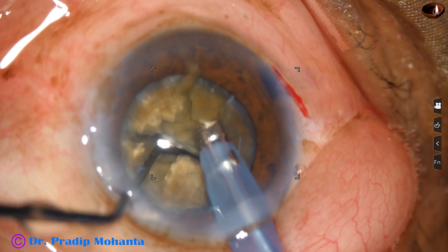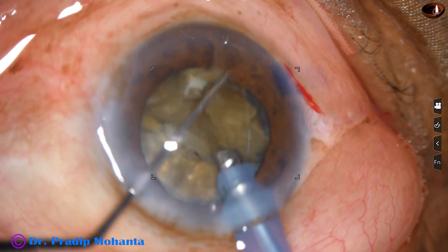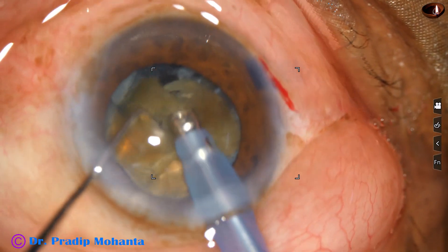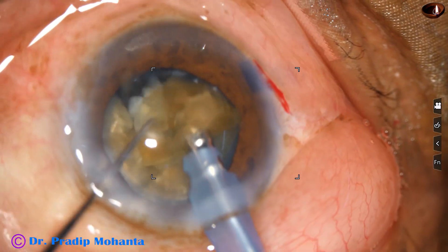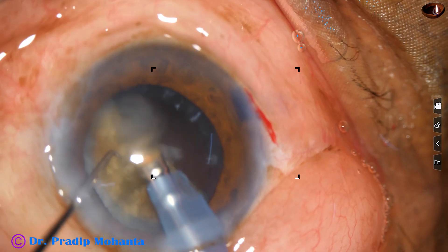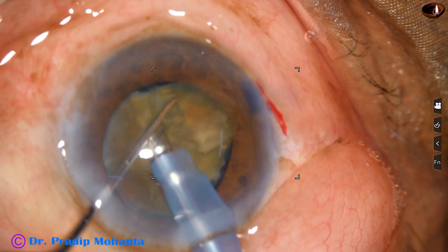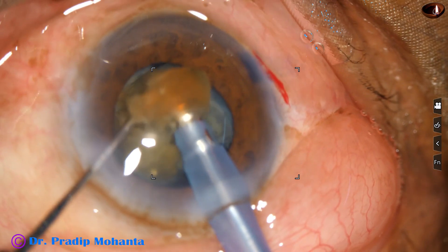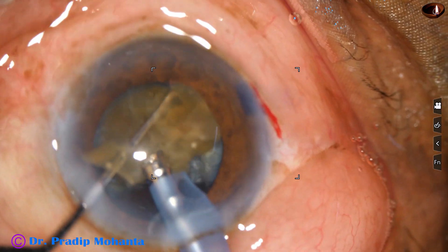So what to do now? I go behind this piece and with the blunt chopper, I tent up the joining part of the fragments and apply ultrasonic energy at that area — and the pieces get separated. Watch it here again: the peripheral part is cracked but the central part is not. Tilt it and apply energy on the fibrous, leathery bands that join the fragments, and as I apply ultrasonic energy there, the pieces get separated.